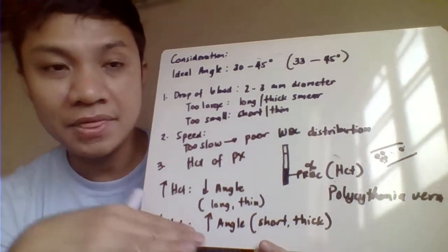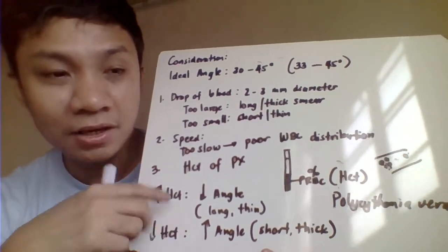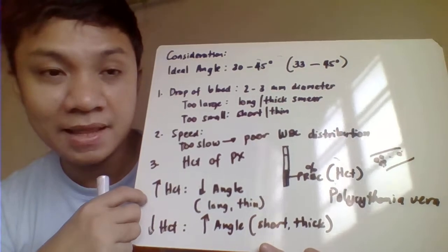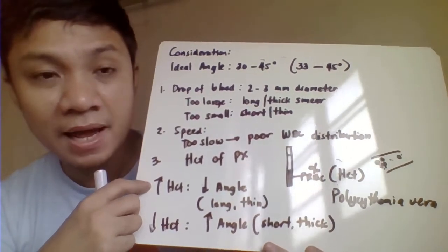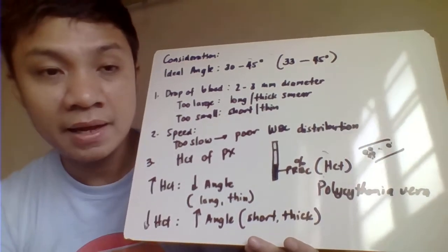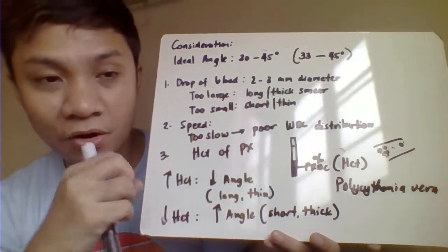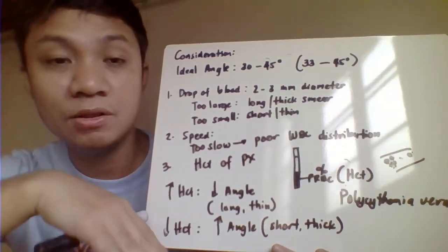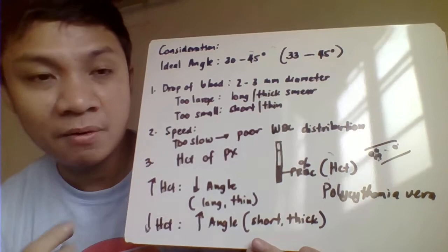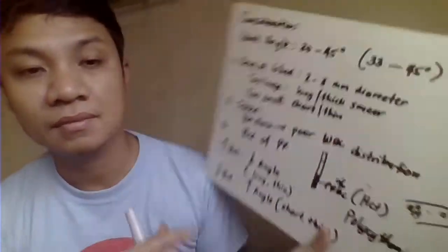Again, pag thick ang film. Another thing here is pag increase hematocrit or malaki ang drop ng blood natin, pareho lang sila, lower the angle. Ito naman, pag mababang hematocrit, sobrang konti ng drop ng blood mo, then you try to increase your angle in order for you to at least have more or less okay na blood film after doing that one.